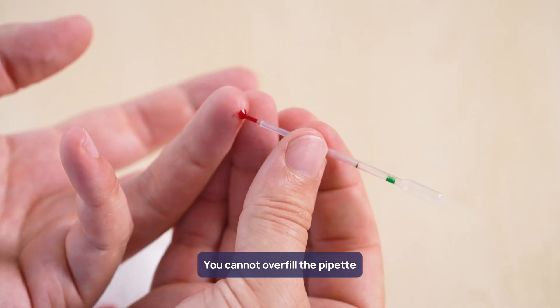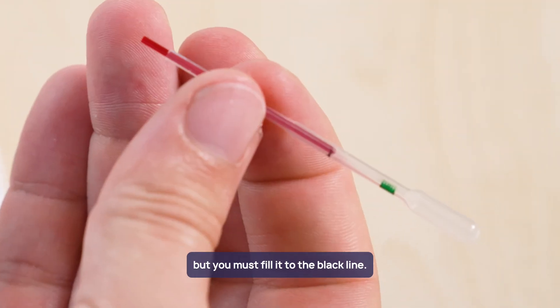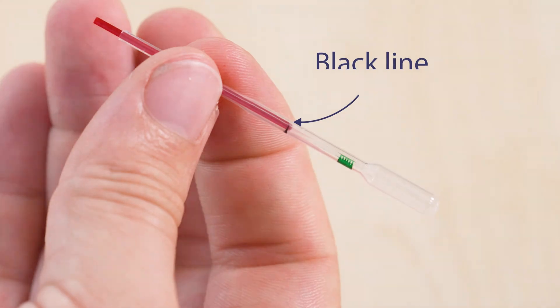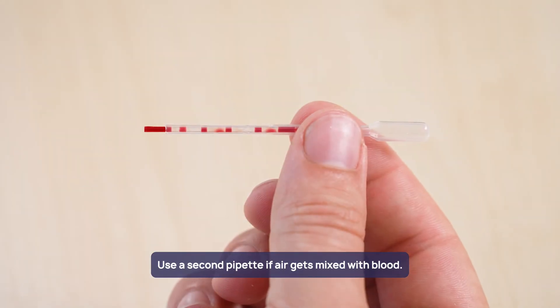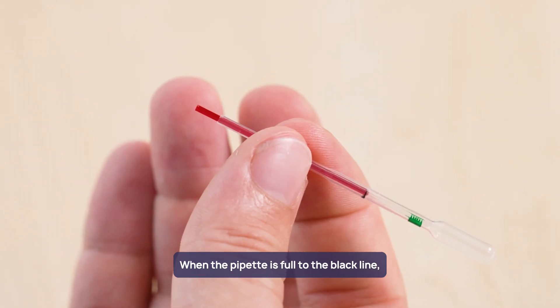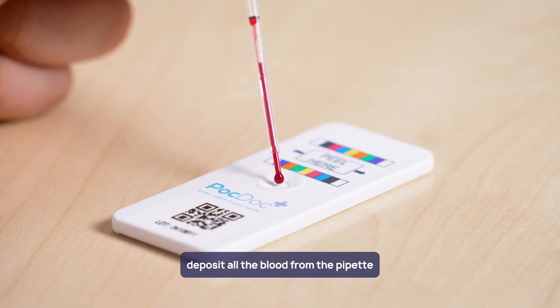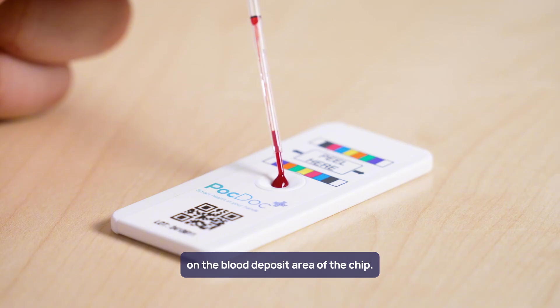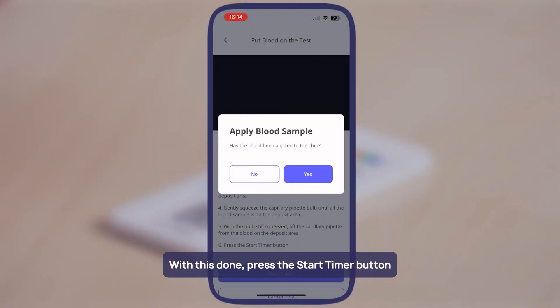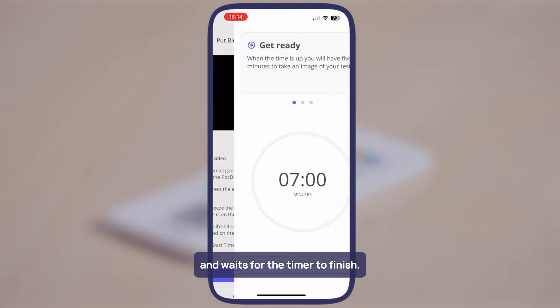You cannot overfill the pipette, but you must fill it to the black line. Use a second pipette if air gets mixed with blood. When the pipette is full to the black line, deposit all the blood from the pipette on the blood deposit area of the chip. With this done, press the start timer button and wait for the timer to finish.